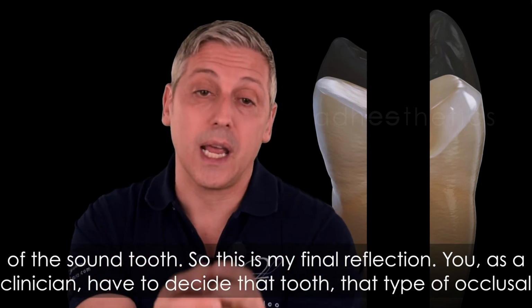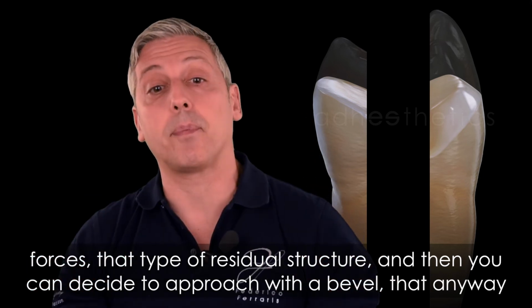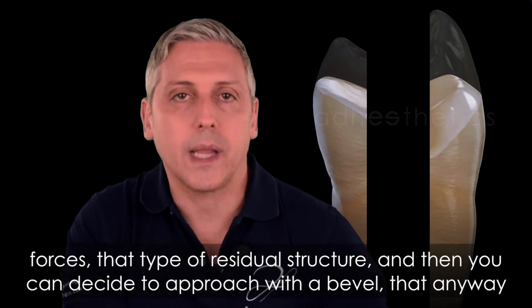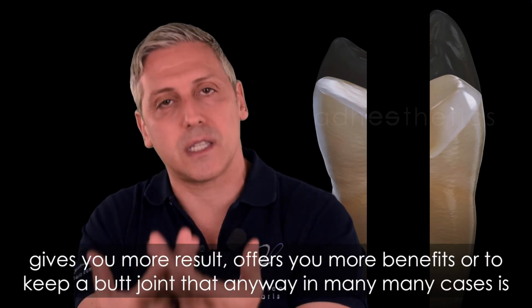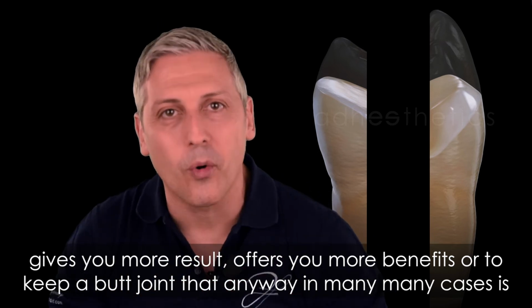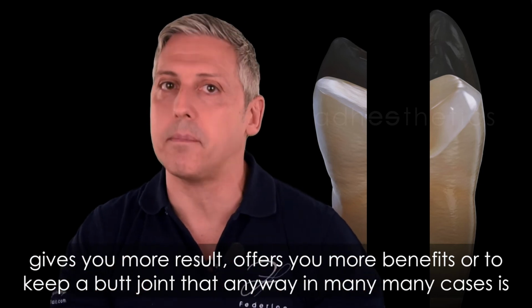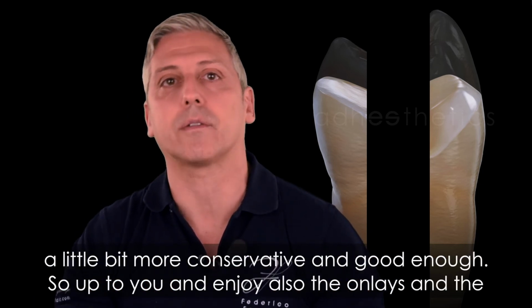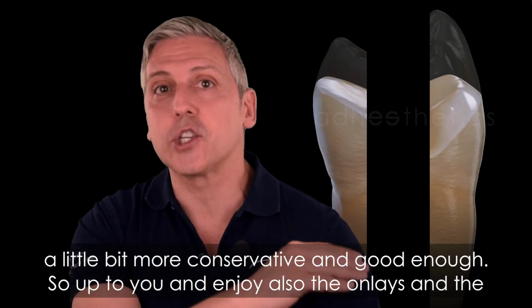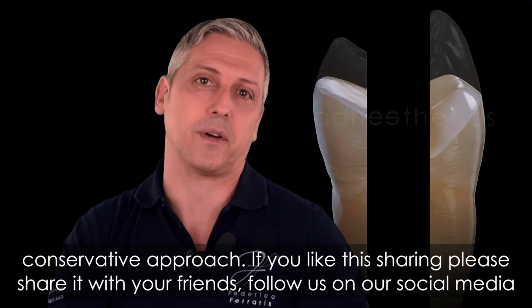You, as a clinician, have to decide based on that tooth, that type of occlusal forces, and that residual structure. Then you can decide to approach with a bevel, which anyway offers you more benefits, or to keep a butt joint, which in many cases is a little more conservative and good enough. Okay, so it is up to you, and enjoy the onlays and the conservative approach.